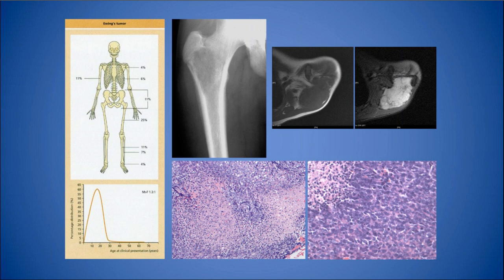The tumor is more common in males, and characteristically, it appears as a lucency within the bone. Most of the times, it doesn't have any type of perilesional sclerosis or any internal sclerosis that indicates matrix production. And one of the characteristic features is the formation of a lamellated, onion skin-like pattern of periosteal reaction. It is characteristic but not pathognomonic of this condition, because this same pattern may be seen in other conditions like Langerhans histiocytosis and even in osteomyelitis.